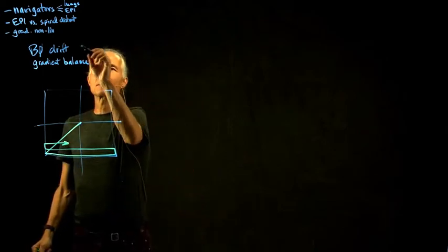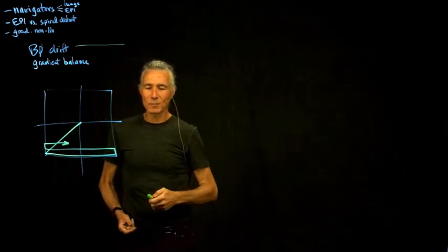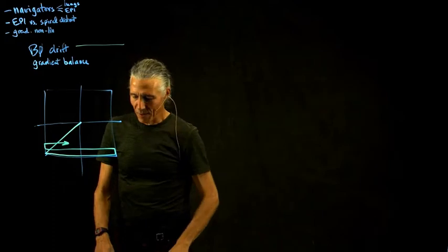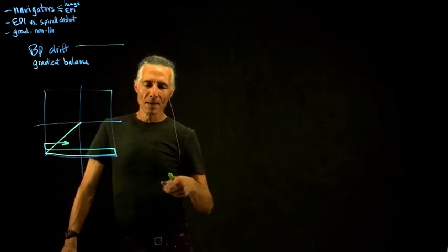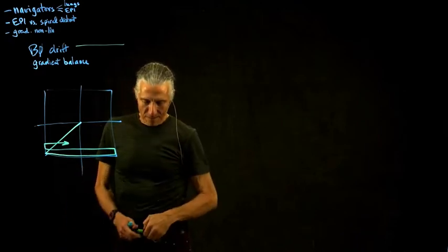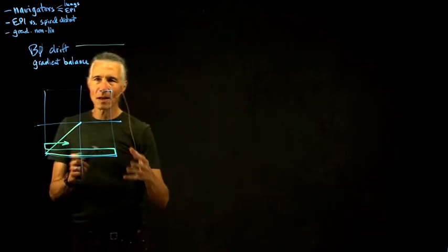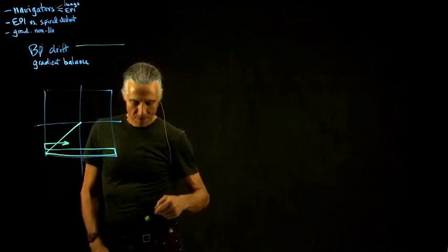It drifts not very much. So what is drift? Drift just means the B0 field gets slightly less strong. We said that we have a superconducting magnet, which means there's no resistance, which means that the B0 shouldn't drift at all. But in fact it does, on a very regular basis, because there are various other ways of extracting energy from the magnet.